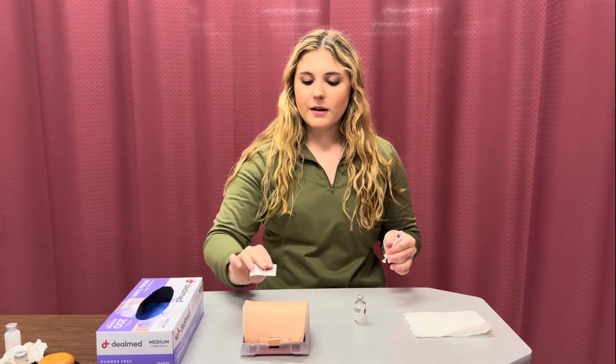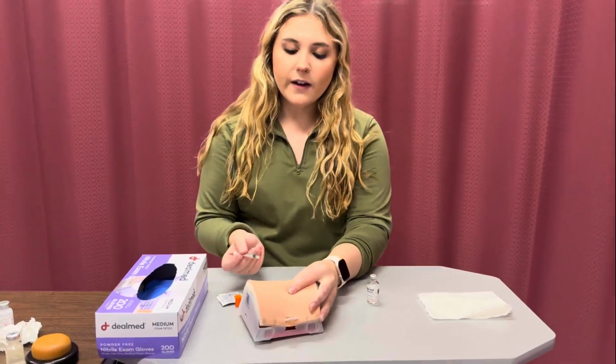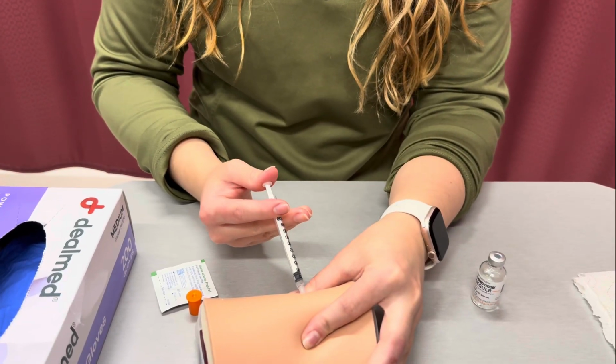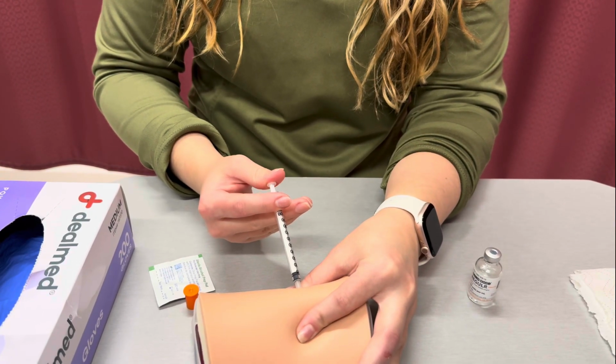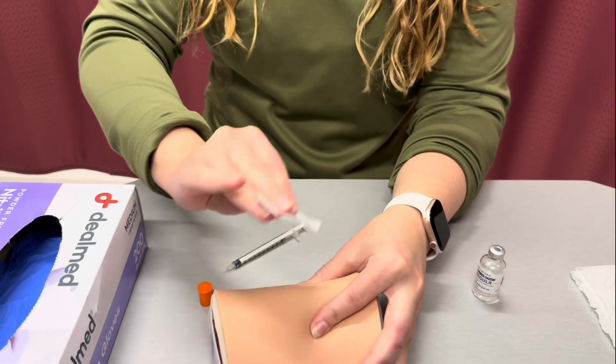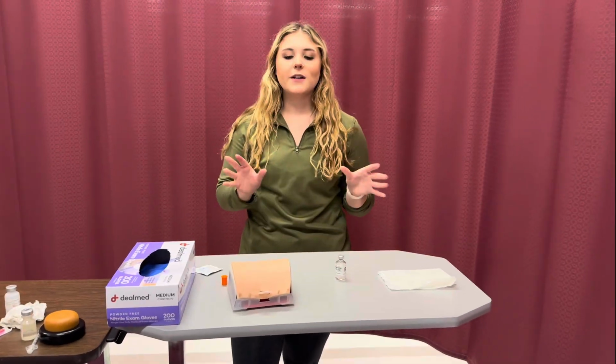Alrighty, I would clean off my patient's skin, grab about an inch, and I'm gonna go at a 45-degree angle. Okay, there we go. Would clean off the area. Before leaving the room, I would again practice bed safety and make sure my patient is okay.